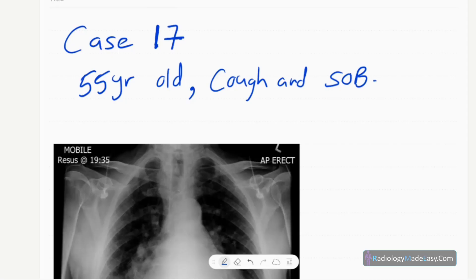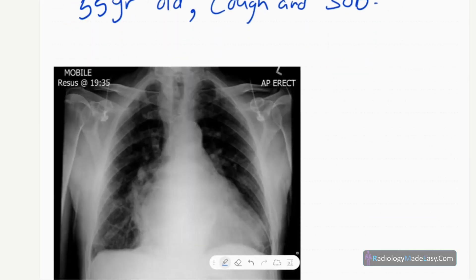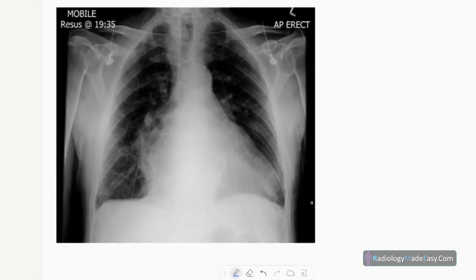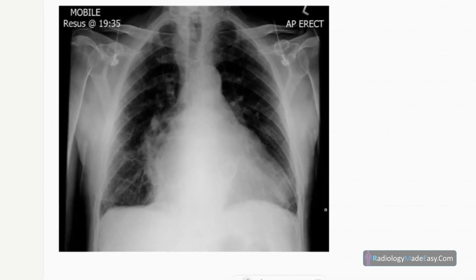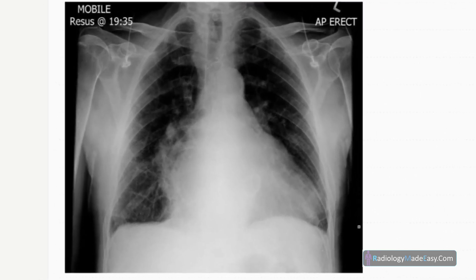Welcome back everyone. This is case number 17 of our RS series in radiology. Our case today is a 55-year-old male patient presented with chronic cough and sudden onset shortness of breath. This is the anteroposterior erect chest radiograph.